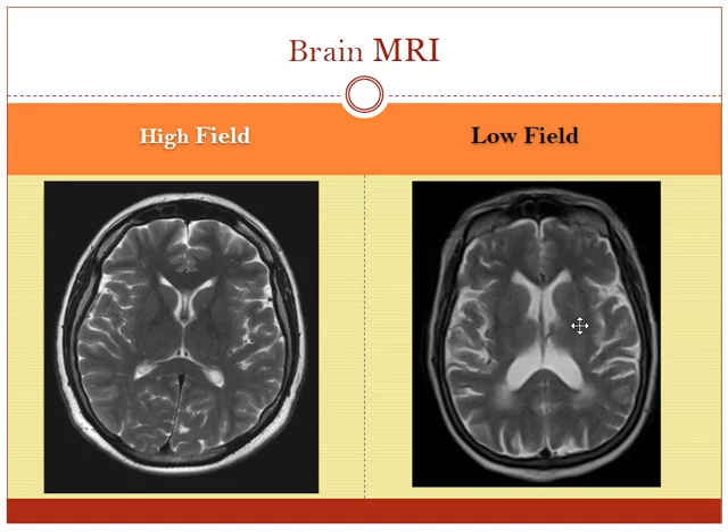For the brain MRI, this is a high field scanner on the left and a low field scanner on the right — they look very, very similar. It's really dependent on the low field MRI scanner; there's lots of variability. High field scanners usually all look good, and low field MRI scanners sometimes are very good for brains, other times the scanner just doesn't do as good a job.